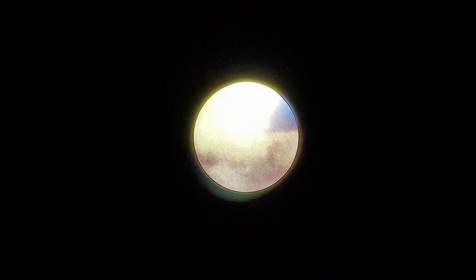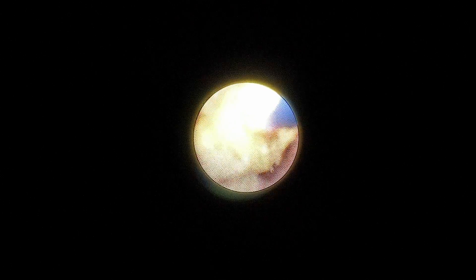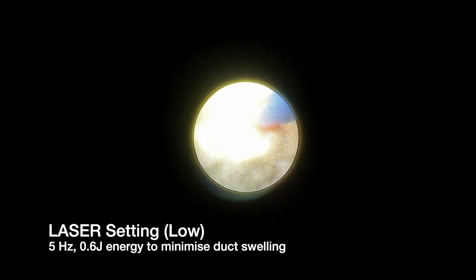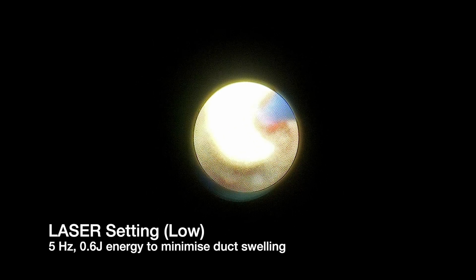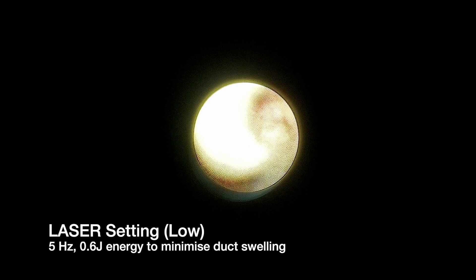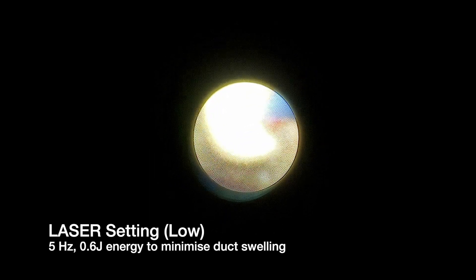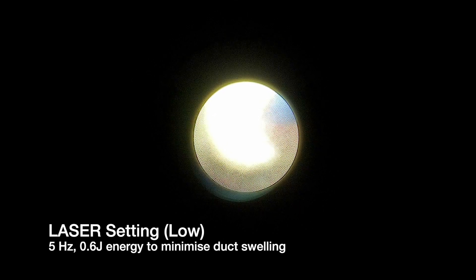Care must be taken to keep the stone in the center and to see where the laser is being fired. The laser can have deleterious effects on the duct, so we make sure the fiber never comes into contact with the duct walls, which may cause inflammation and stenosis at a later stage. As fragmentation continues, we are moving in a center-to-periphery pattern to minimize ductal trauma.